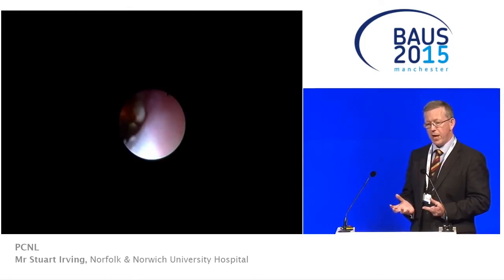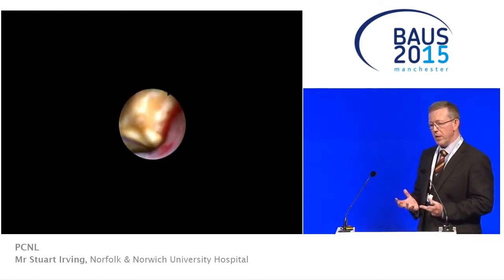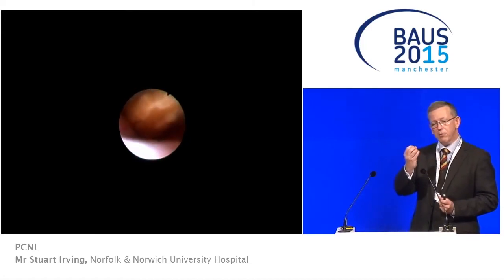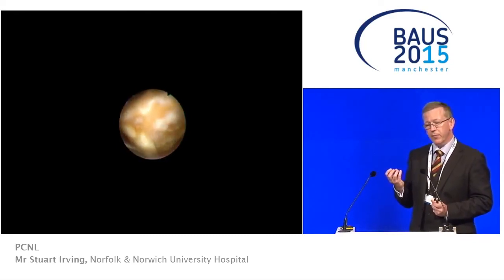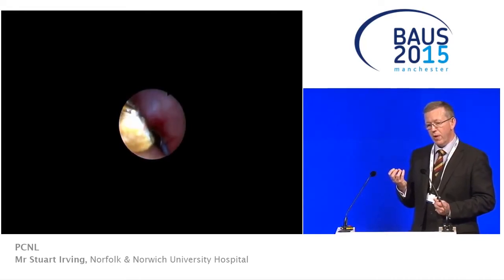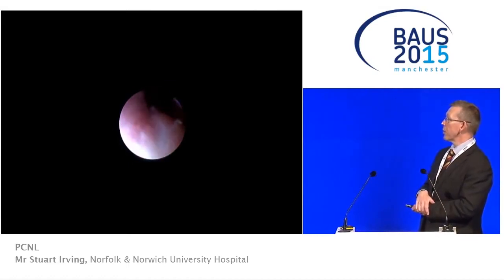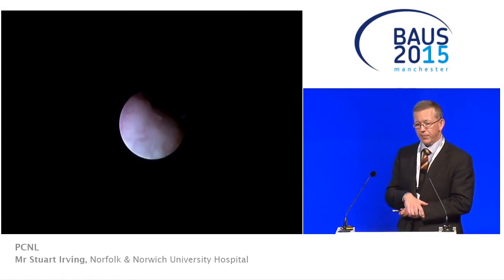This step is heavily edited. This was very fiddly to do. I'll show you the flexible ureteroscopy series from this part. But what we found is we were constantly having to move the sheath and the scope from the kidney side back so it didn't impinge on the neck of the calyx. We finally got it into a position where we could move some of the graspers onto it and engage it.